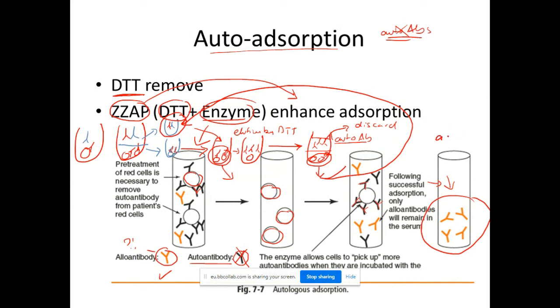Okay, الآن بنسميه adsorbed serum. الآن بتغير اسمه، بنسميه adsorbed serum. ذكرون هذاك سمينا اليوت، وهنا بنسميه adsorbed serum. طيب كل هذه العملية عشان بس أتخلص، كل هذه العملية عشان أنا أتخلص من الأوتو أنتيبودي.